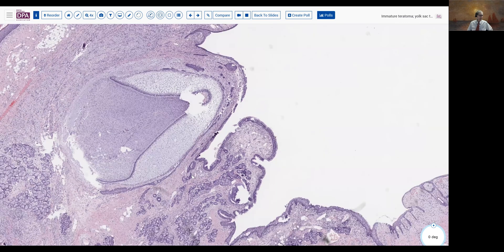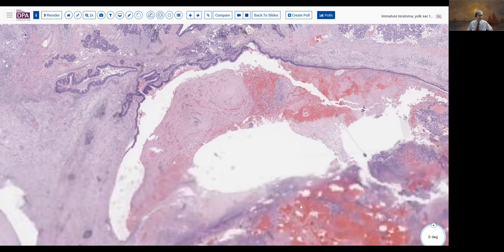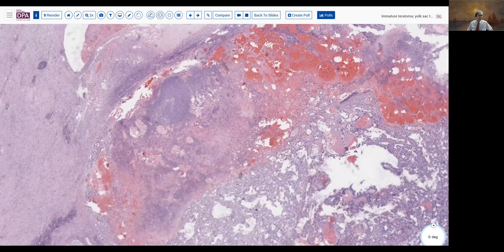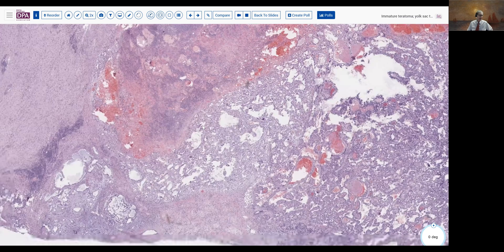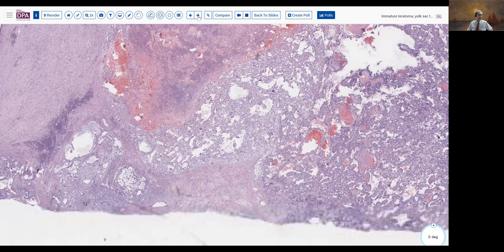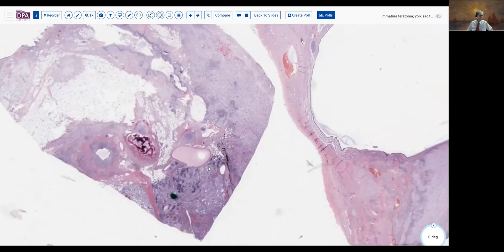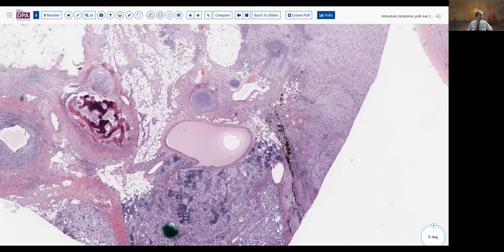Interestingly, on this slide we did not identify immature teratomatous elements. We did have more of the yolk sac tumor. As you examine this, you of course want to be alert to make sure that there are no other mixed germ cell elements — that's dysgerminoma or embryonal carcinoma — which we did not identify. One additional slide was located which did again have an area of immature teratoma in this corner. In addition, we have some immature cartilage and epithelial structures, and again bone, fat, and mesenchyme.